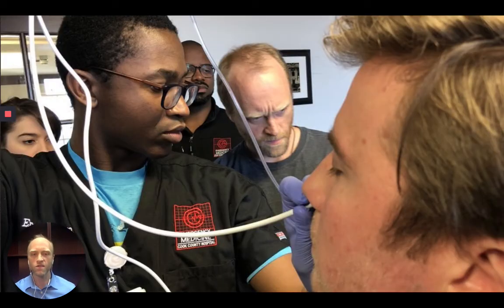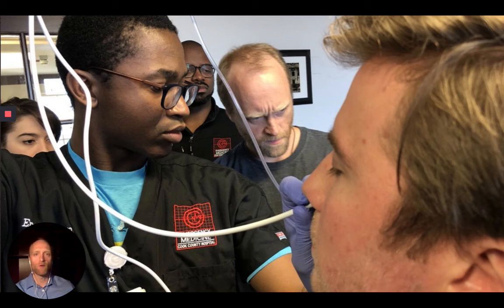So after a session to familiarize yourself with the scope, the next step is to use your skills on a real person. This is also how you will gain competence in performing topicalization. I think it's great if two or more physicians who are learning the procedure can meet up and practice on each other with mentorship from someone experienced in the procedure.